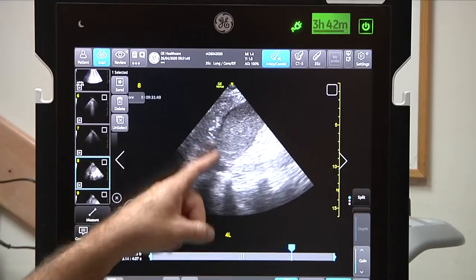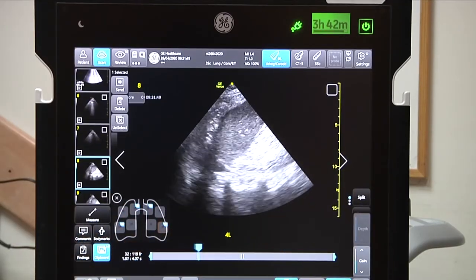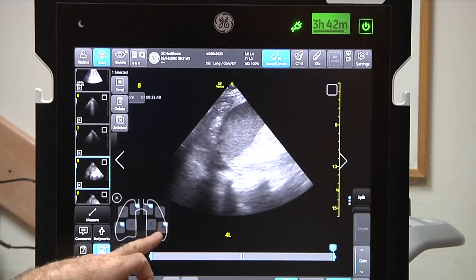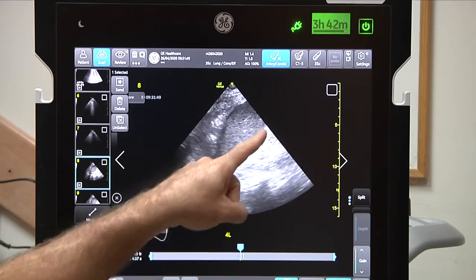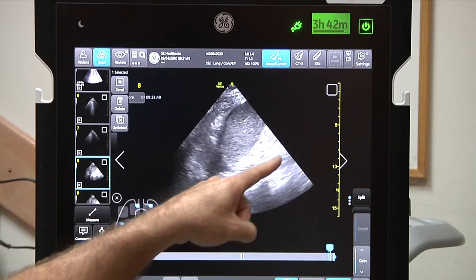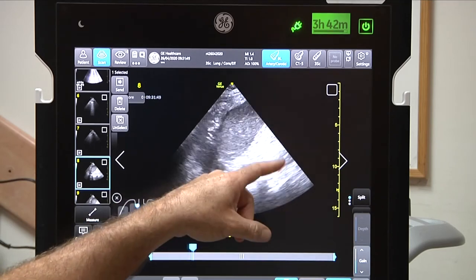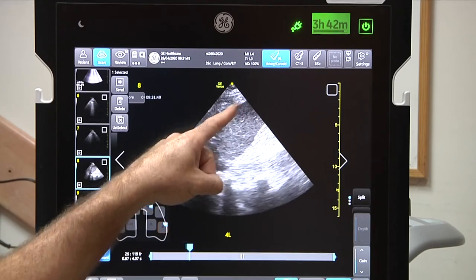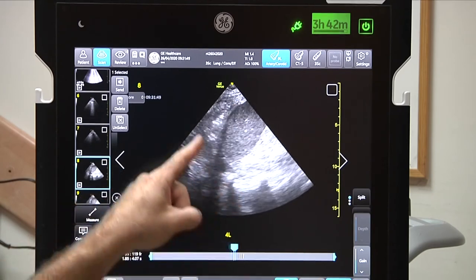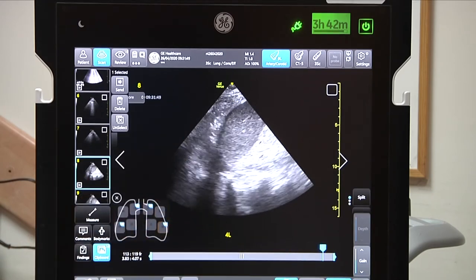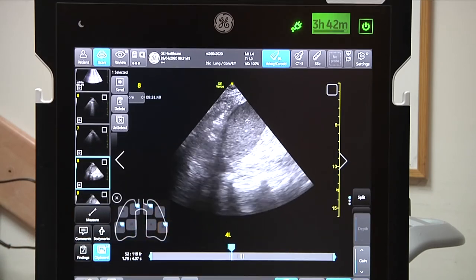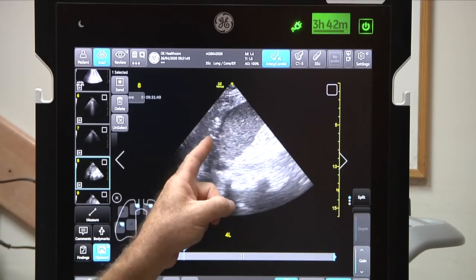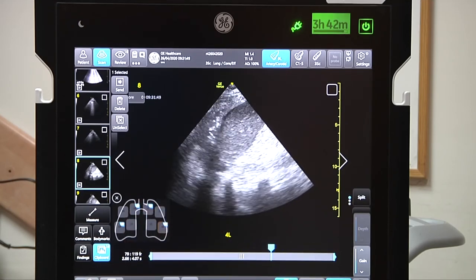Here we demonstrate the left lower zone, as you can see from the lung diagram, with nice imaging of the spleen, the kidney, the diaphragm, and above that, a consolidation. This is a left lower lobe dynamic air bronchogram, meaning left lung consolidation.